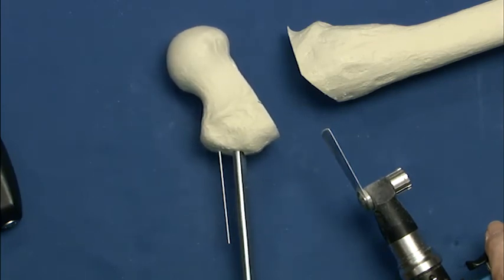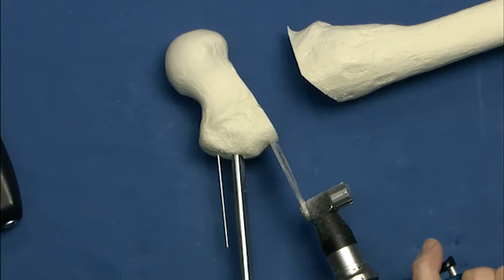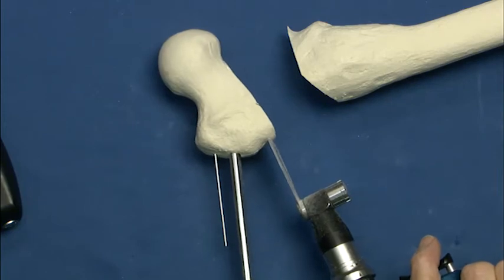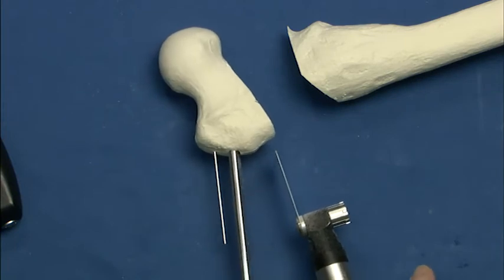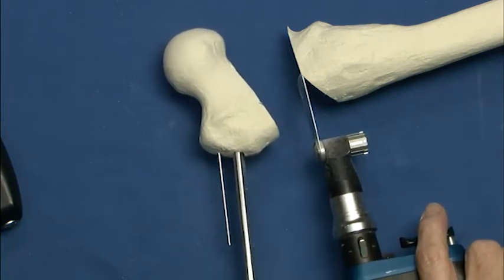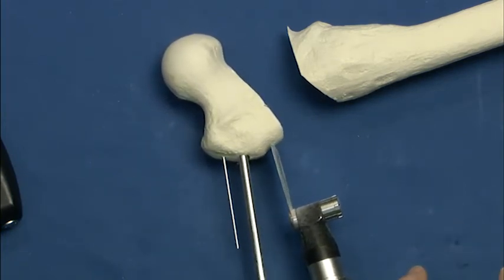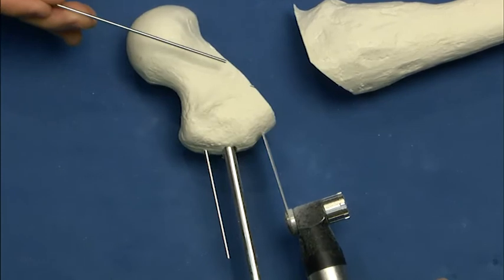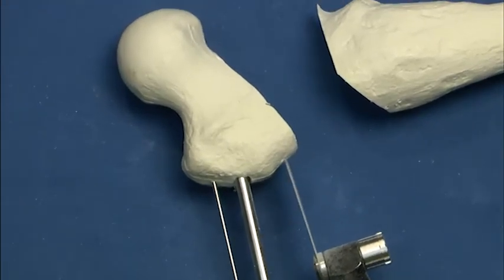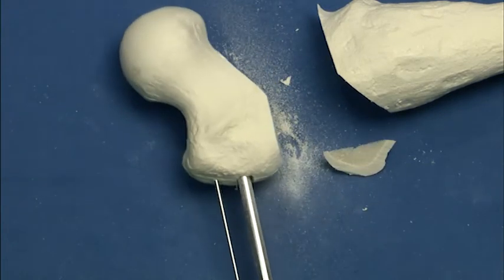So now we're down to the final component to get our last plane of correction. So we want to get the sagittal plane, which means we have to take an anterior closing wedge from the proximal segment to compensate, and this cut will be parallel to the seating chisel, which makes it relatively easy, but it's not going to go all the way across, because remember, our point of contact is only going to be here. So we can do this almost freehand by coming in parallel to the blade, and I'm looking at the posterior cortex, and I don't want to go very far across. Okay, that's what we have now.